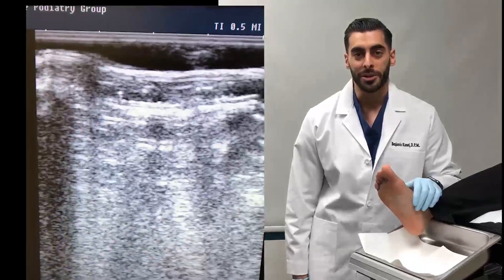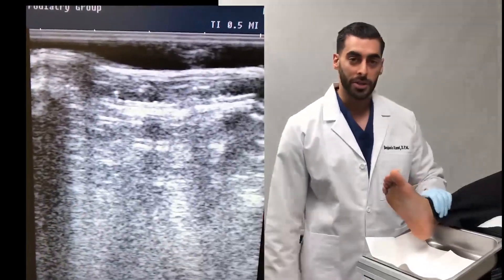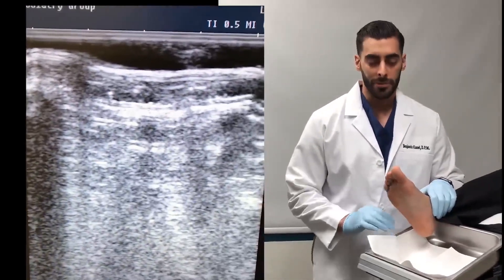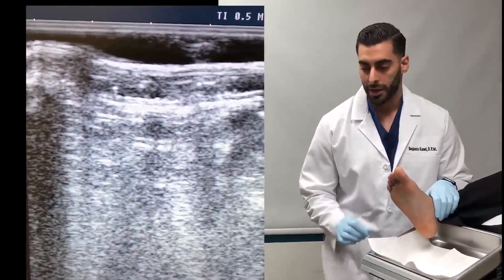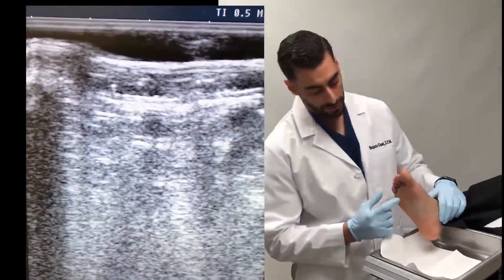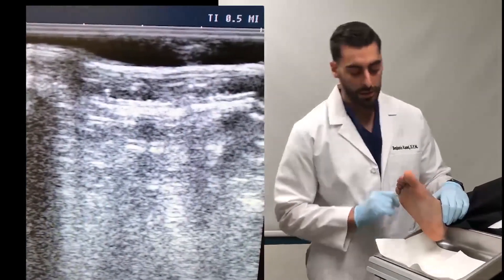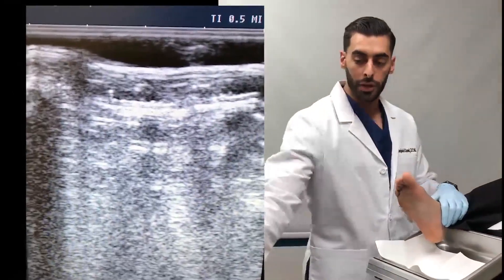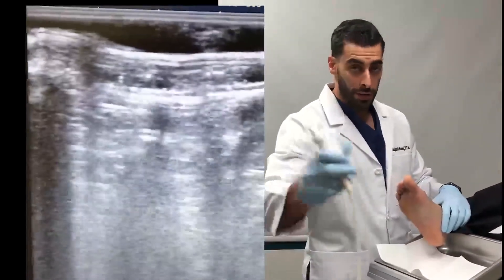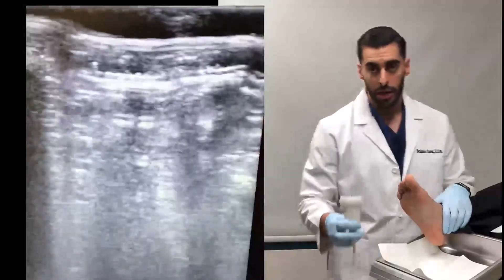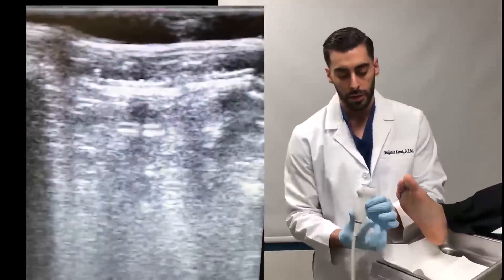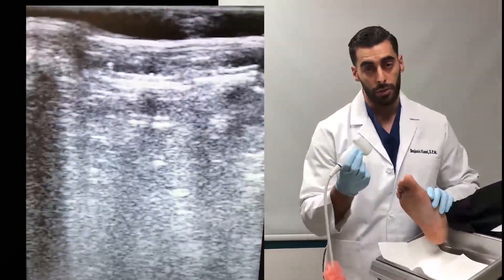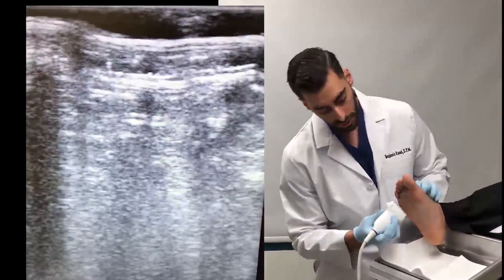As far as patient positioning, we have the patient in the supine position, normally seated, foot is dorsiflex, and we have good access from the plantar view, but we could also do the same thing from the dorsal, and I will show you that now. The first is going to be a longitudinal view of the intermetatarsal space, so you're going to have the probe oriented longitudinally.